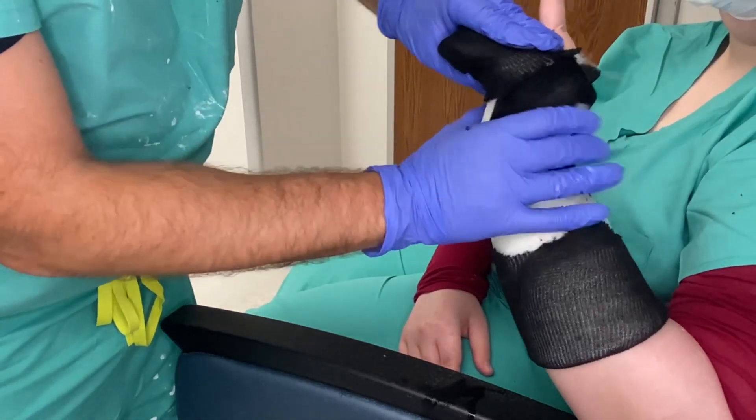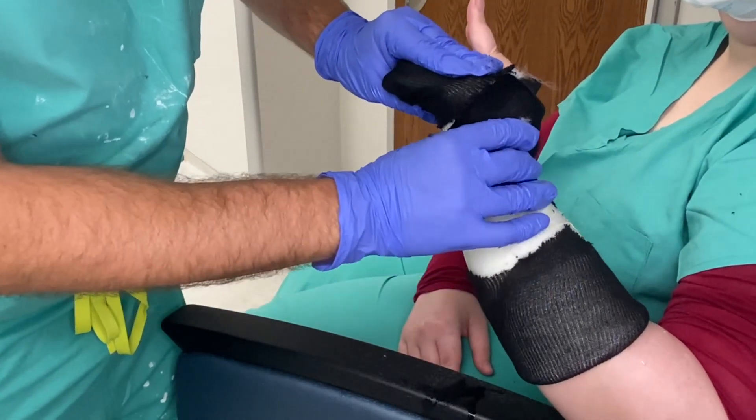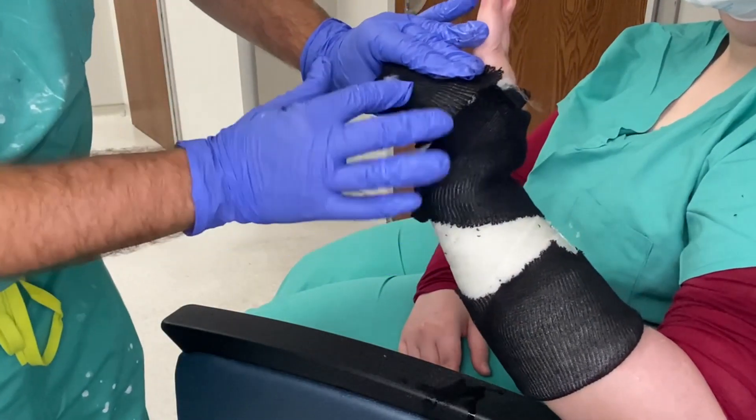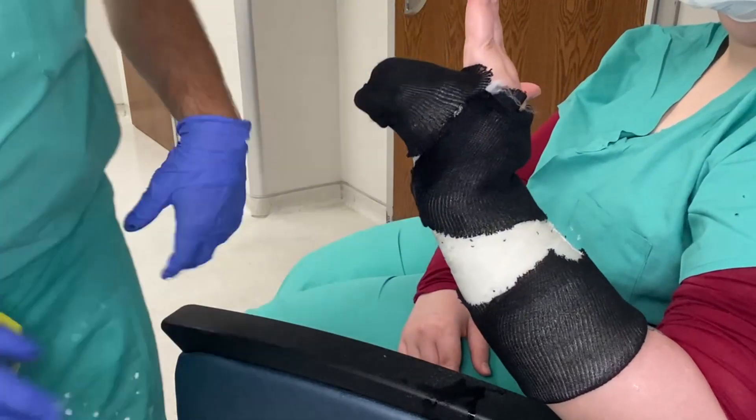Make sure you mold as you go — if you're not a fast roller, you definitely want to mold as you go. You want 30 degrees extension at the wrist and 90 degrees at the MP joints, pushing down on the knuckles. Once the white fiberglass is on, you can go straight to the color.